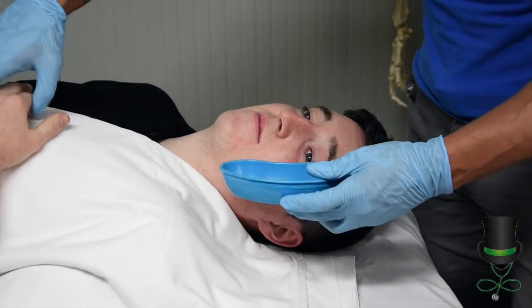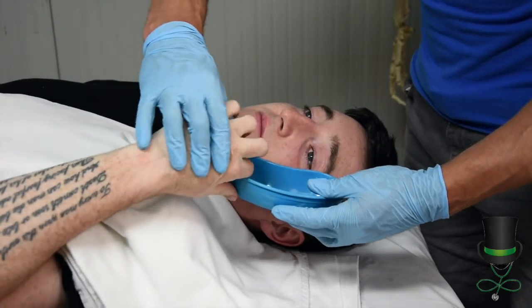Next, get your basin. Get the patient to hold it close to their face to catch the flow of water.